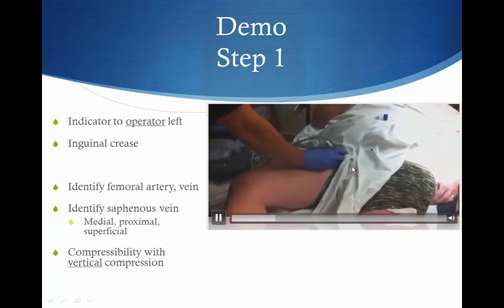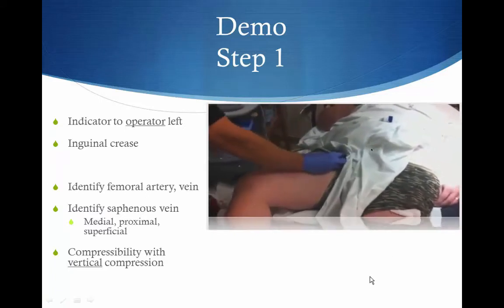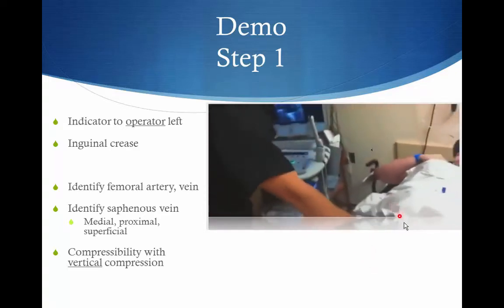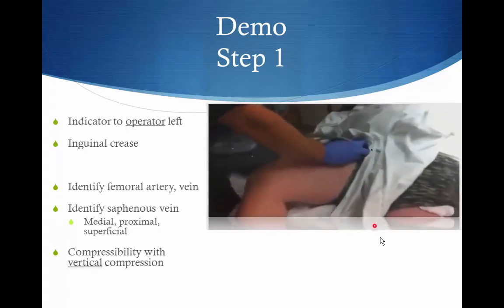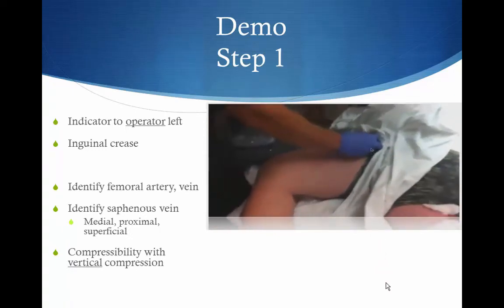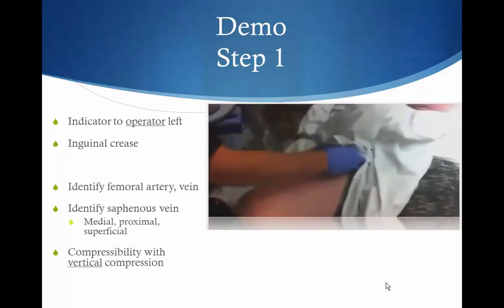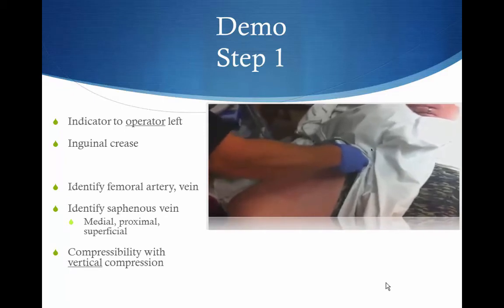So right in that inguinal crease, kind of following the plane of the inguinal crease. And we fan kind of towards the patient's head until we find that saphenofemoral junction. I'll show you what that looks like here in a second. And look at that. Compress. Straight up, straight down. Straight up, straight down. Straight up and down.